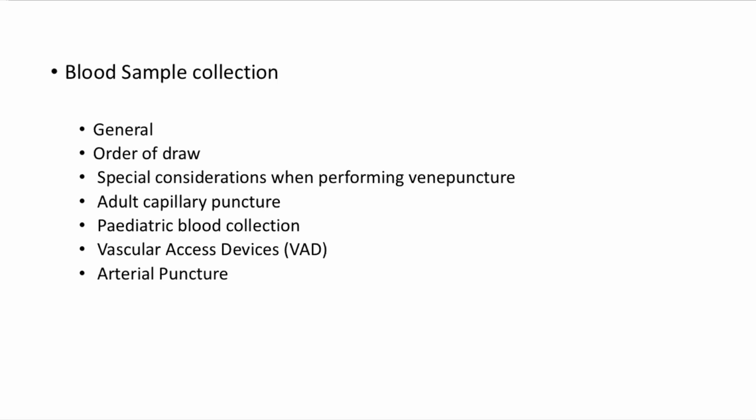Sometimes they use very fine bore needle, so that shall not be used. Or if a patient is receiving IV fluid, or they have cannula in place and you want to collect sample from that cannula, what is the correct procedure? So all these things sometimes clinician want to know, or if a patient is receiving IV fluid, sample shall not be collected from the same. So these are the different things which we discuss with the clinician. Or if it is ABG, how arterial sample shall be collected. So that is very important to know.